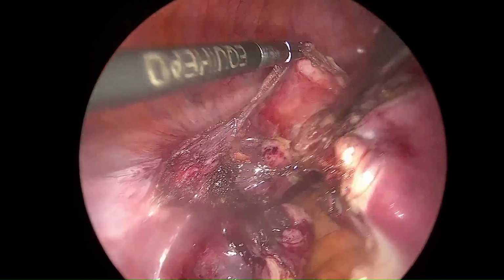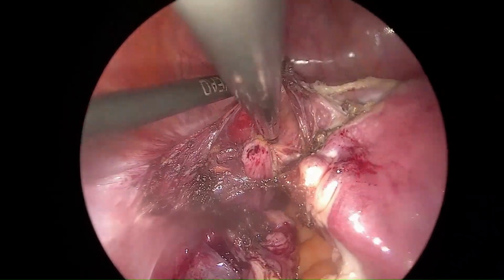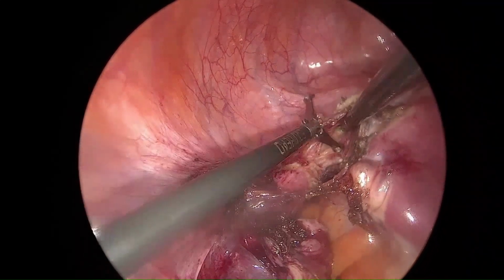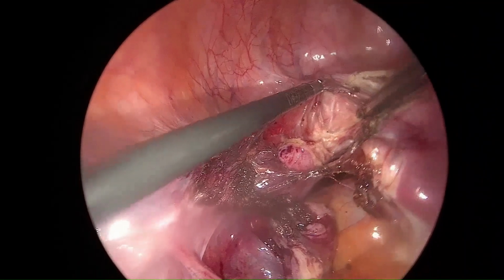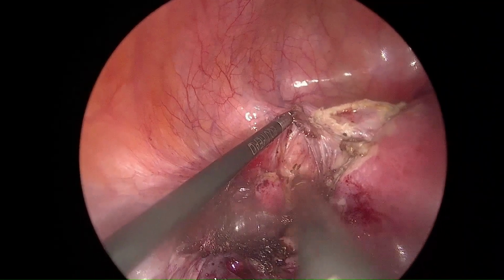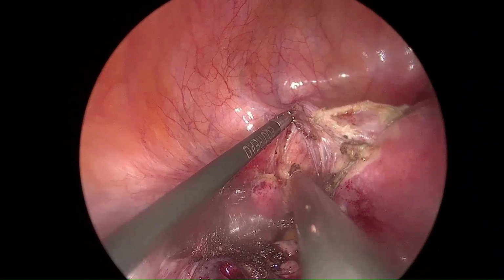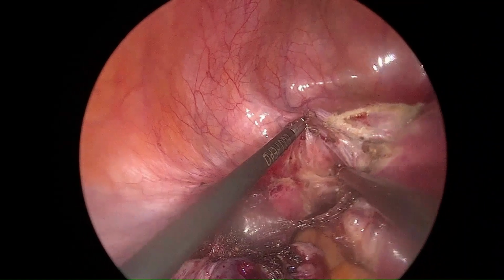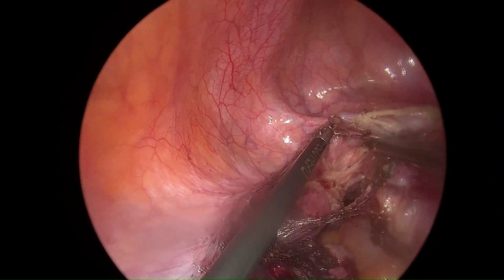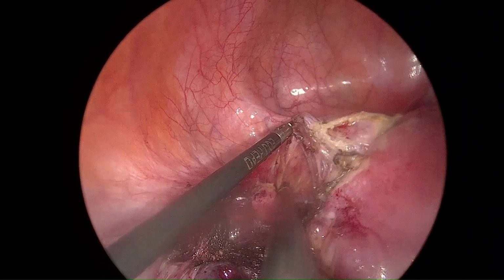After separating the peritoneum, now we will concentrate on the lateral window creation. First, the bladder flap is lifted up using Babcock's. Just medial to the uterine artery, draw lines with the bipolar shearer from above downwards. While drawing these lines, you can feel the rough scarred area above and the soft, unscarred area below.